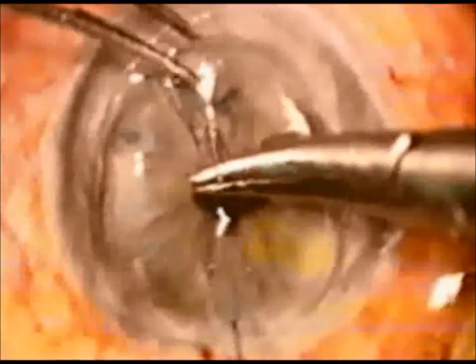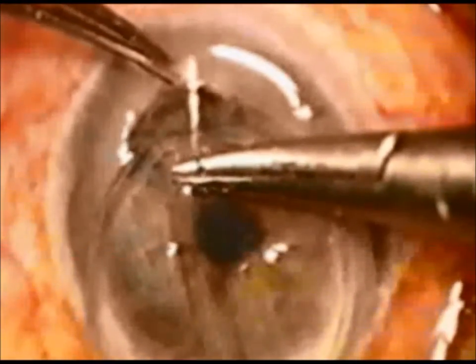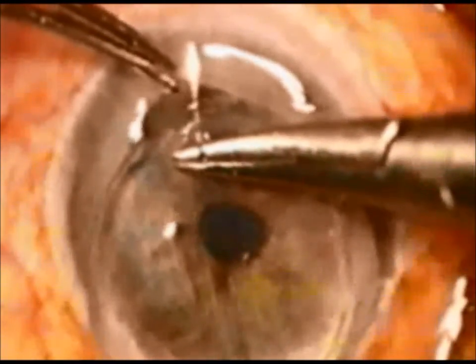The donor button is placed over the host bed. The flange of the graft is engaged with the needle of a 10-0 nylon suture and is tucked into the host pocket, and the knot is tied.